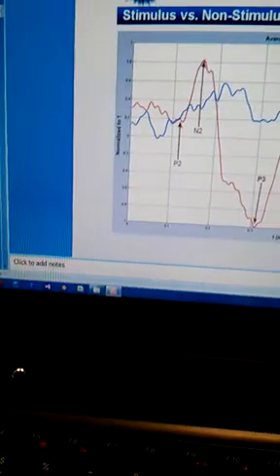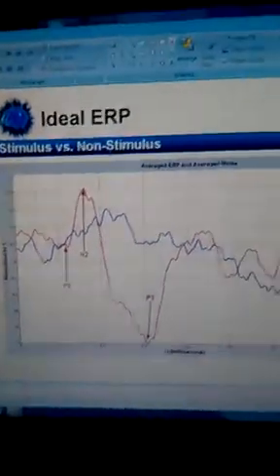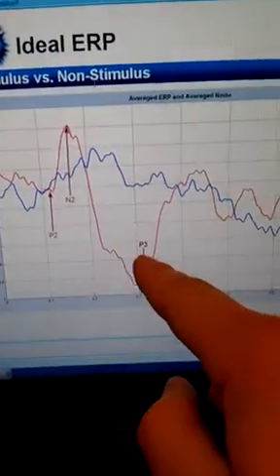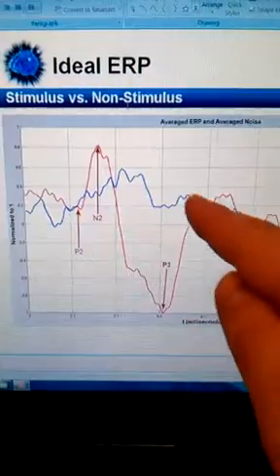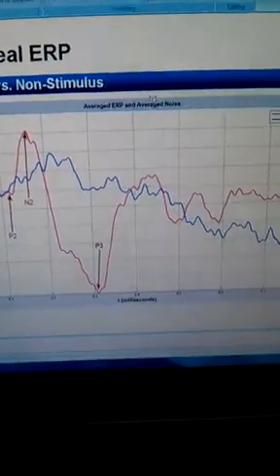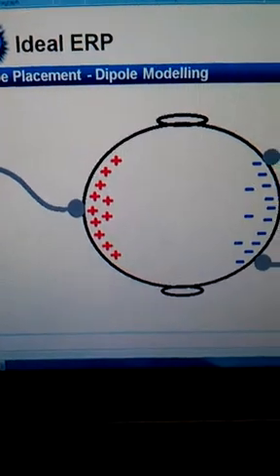And if I go over here, I have results from our earlier experiments. A stimulus happens at time t equals 0, and here we can see the P300 wave happening at 300 milliseconds. The blue is an average waveform of when there was no stimulus, so we can see the difference there. This is how we are measuring the brain waves.